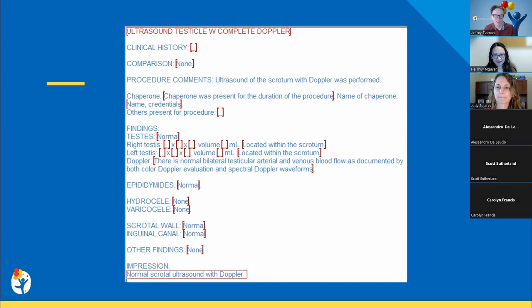So yeah. Another question for you guys. Have you had any luck with importing numbers from the ultrasound machine directly into PowerScribe? That's one of my favorite things about where I work now. When I did my fellowship, that did not happen at all. We had to manually import all of these. So we have something called ModLink.